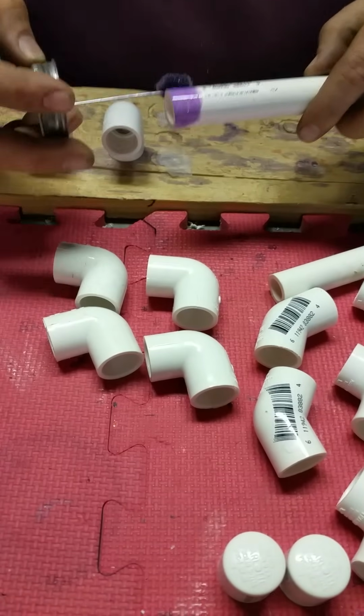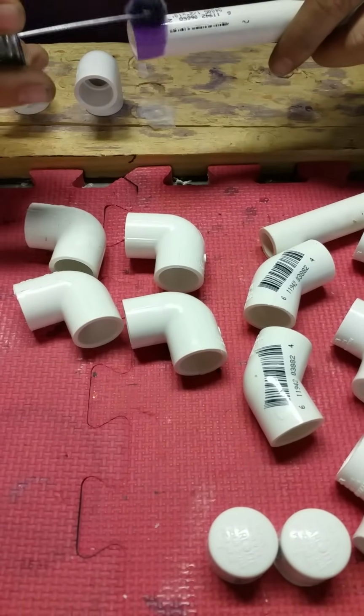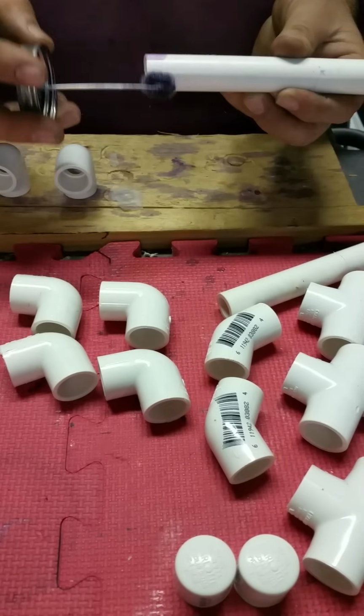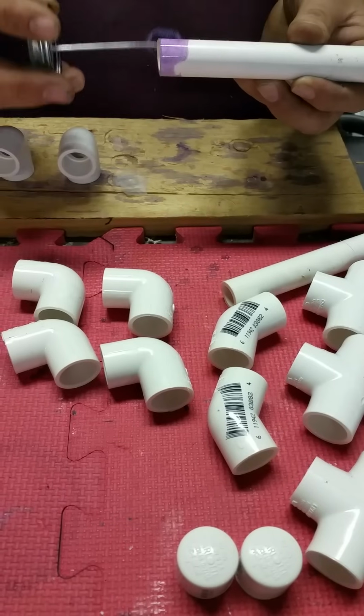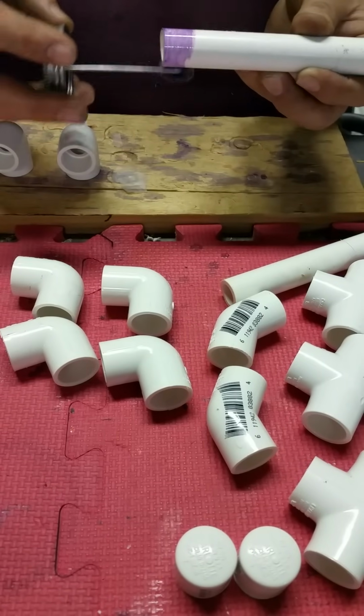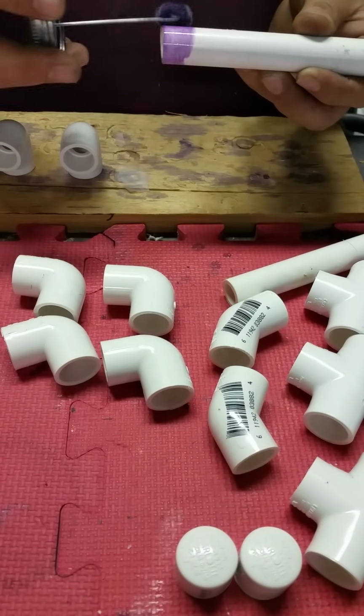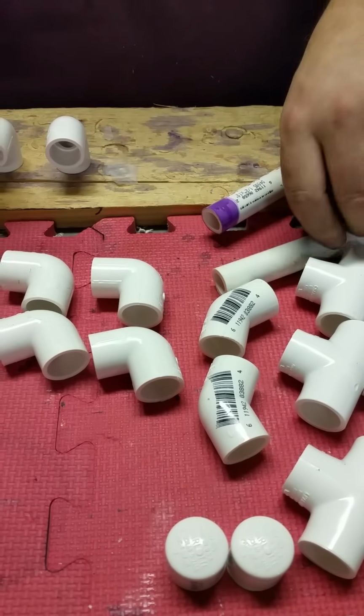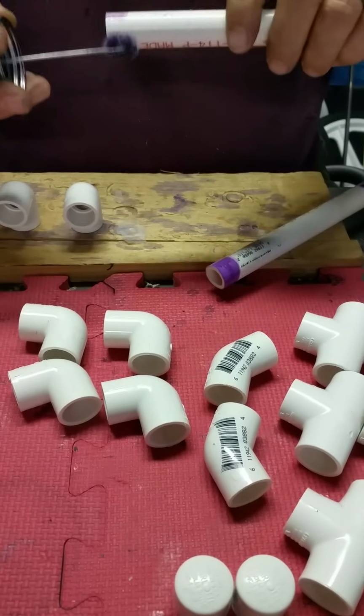When you prime your pieces, you want to make sure that you cover the end, the width of the insertion, which is about the width of the brush, and that you do a good solid job. Go over it a few times. This prepares the PVC for the glue and helps it adhere better.